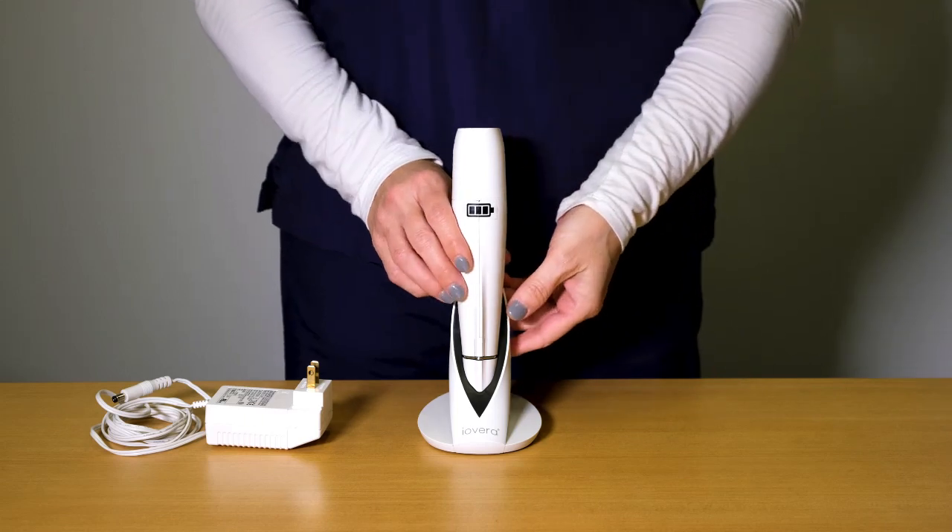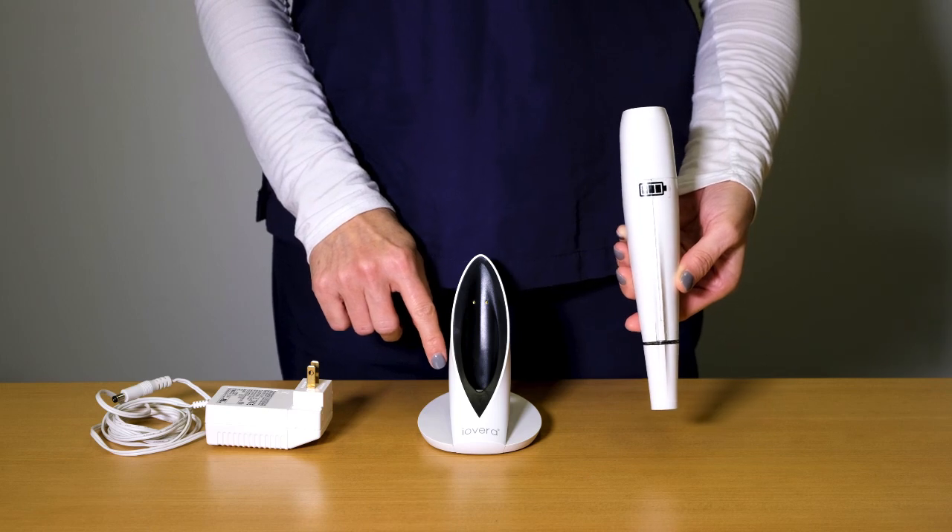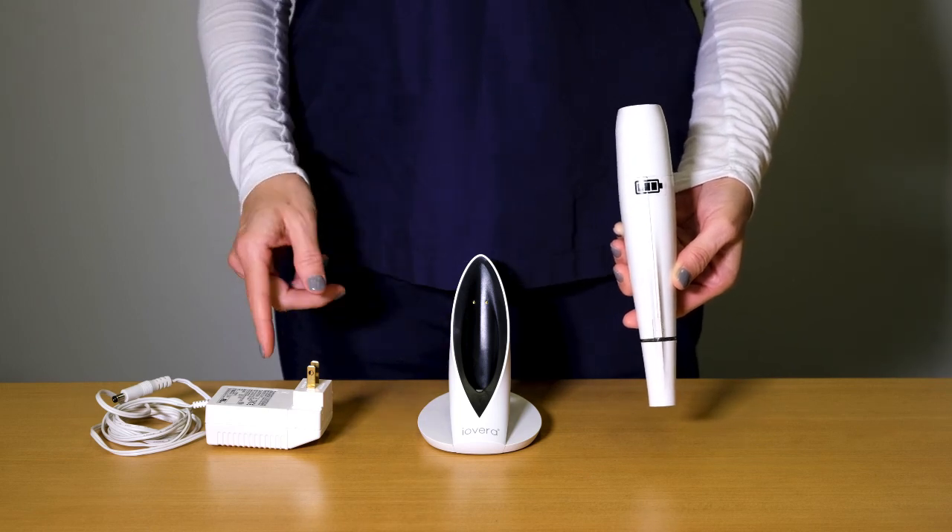Inside the box, you will find the iOVERA handpiece, the charging dock, and the electrical adapter.